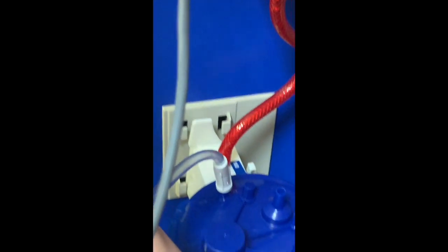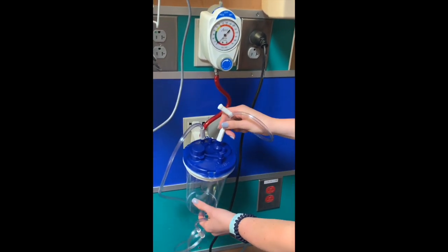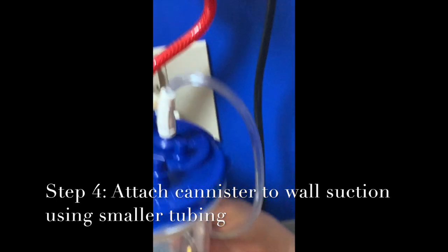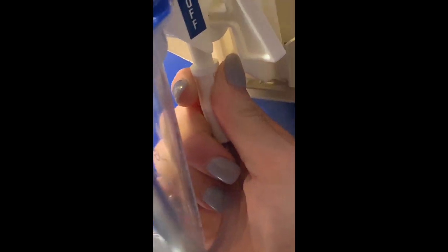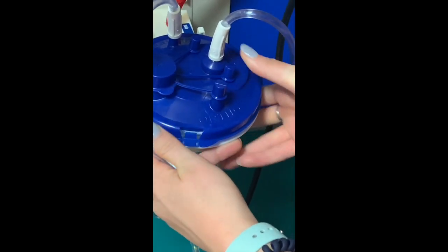You have your tubing set up on the patient end, and this will go to what we're using for suction. This smaller set of tubing gets attached to the vacuum part, which you're then going to attach to your suction machine. On these ones, the attachment is down here, right like this. Perfect. So now that we have this attached, and this is attached to our patient, this third cap is closed. We know we have a closed system here.